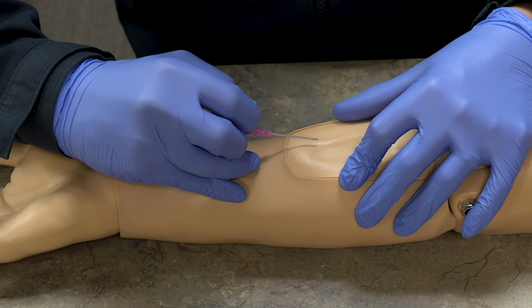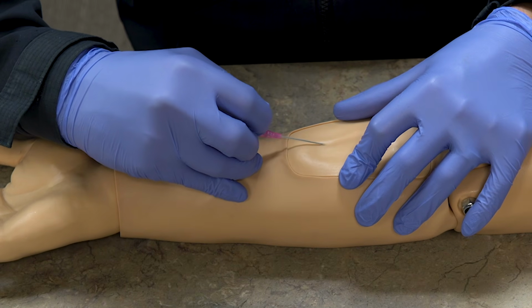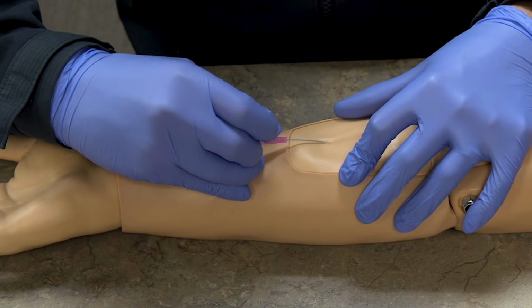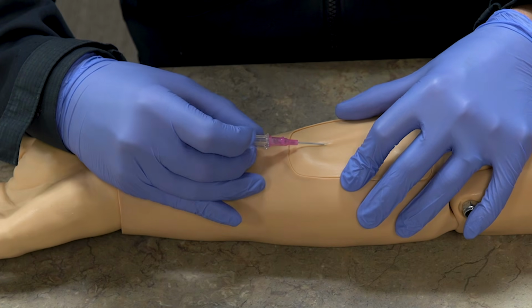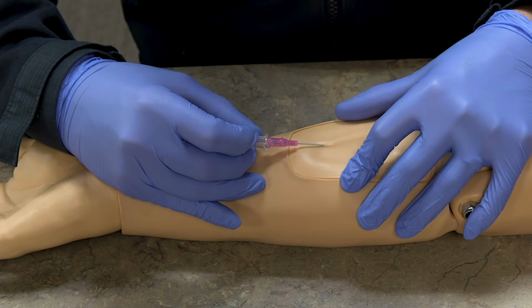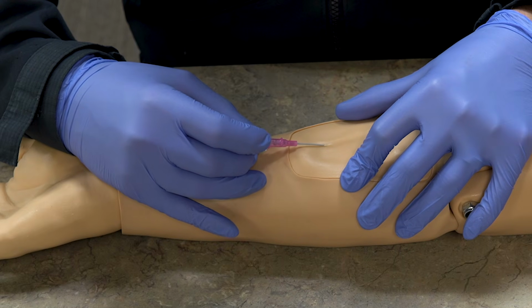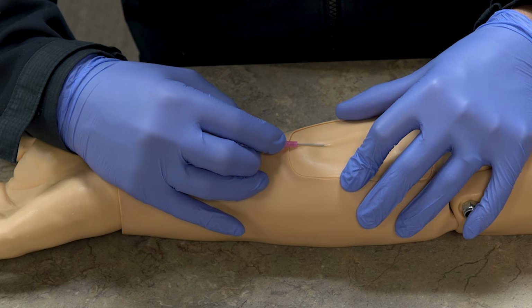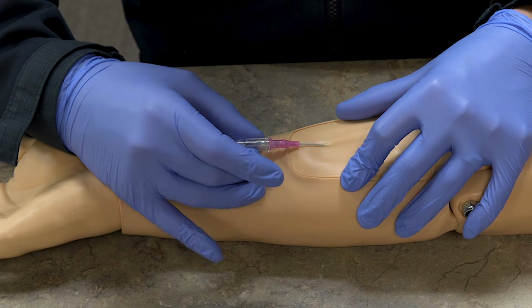So I'm gonna explain to the patient, you're gonna feel a poke, 1, 2, 3, poke, and you're gonna insert it under the skin and into the vein. Now, what you're looking for as you're doing this is blood to come up into this chamber, and that means that you actually hit the vein. That's called flash. So flash is a confirmation that you've hit the vein and the tip of the needle is in there. Once you see flash, you're gonna advance it just a little bit more, and that's to get the plastic catheter where it needs to be.